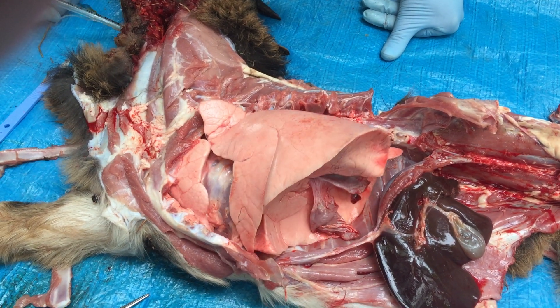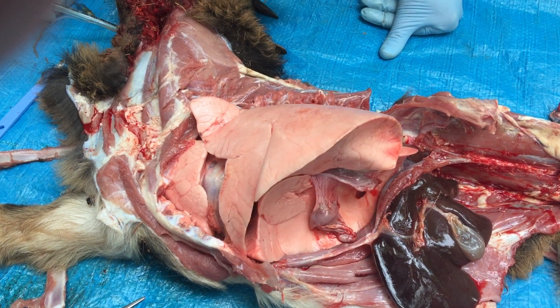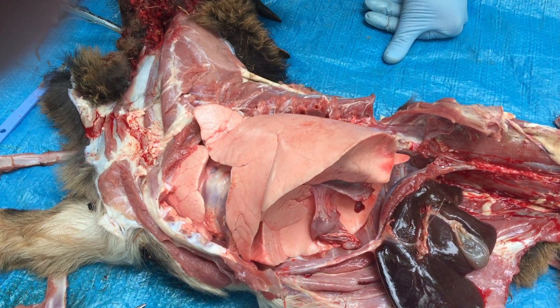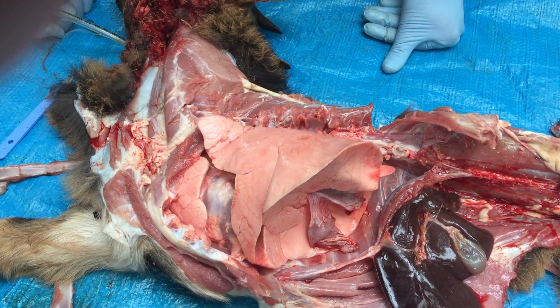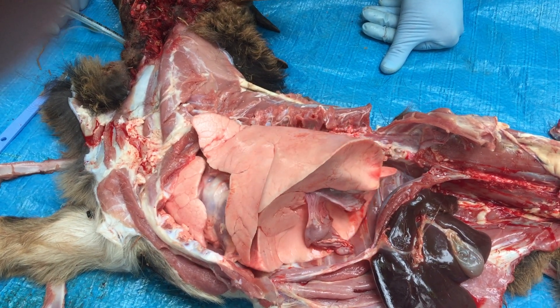So hyperventilate it now with no PEEP. This is like your child in cardiac arrest who you're hyperventilating, and it's going to do so much damage to those lungs. It does show the elasticity of the lungs, even without the chest helping it compress back down. Absolutely.